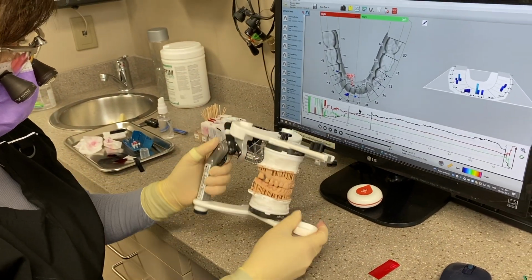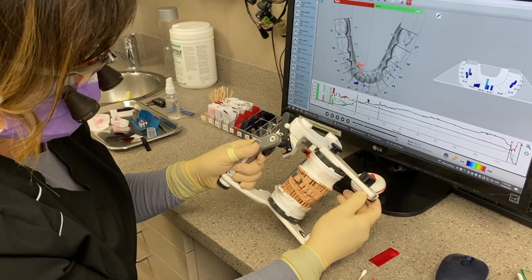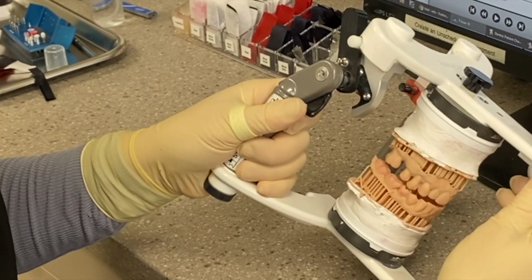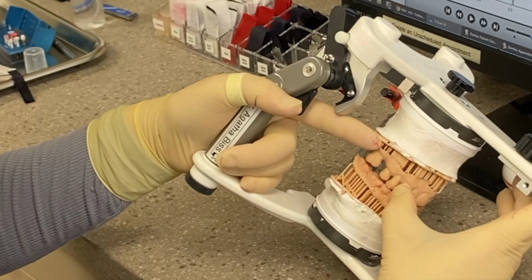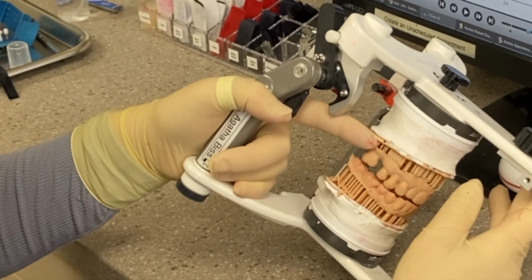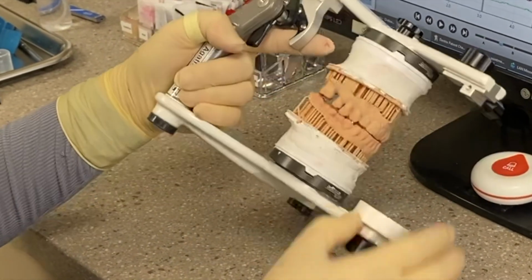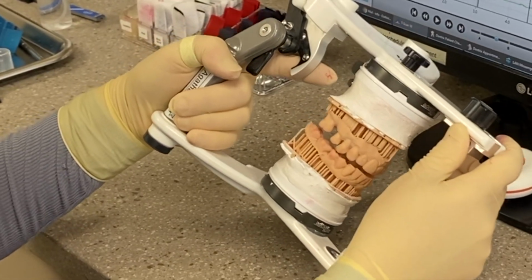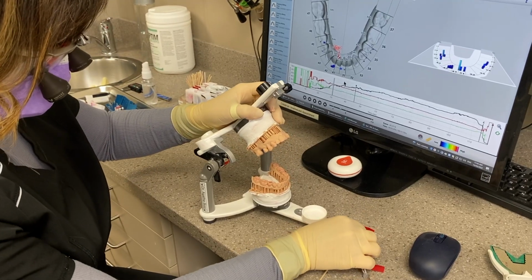So we're just going to unlock the side here, and one side at a time, and just basically look at lateral movements. And you want canine guidance, right? So she's hitting really heavy on that tooth that she's losing bone on, the 1-4. So I'm just going to mark it, and we basically want to build her into canine rise. And I'm not sure if that's going to be possible without some management of the 1-4, because there's probably going to be some damage to it. Let's just see.